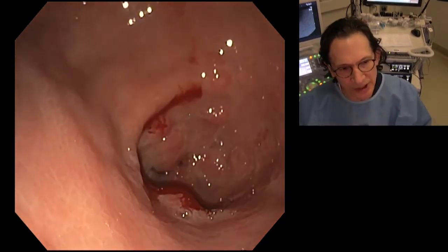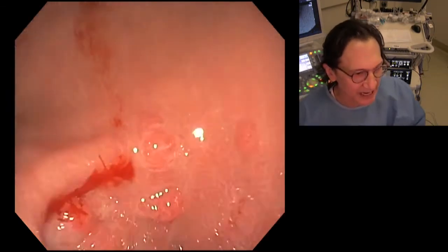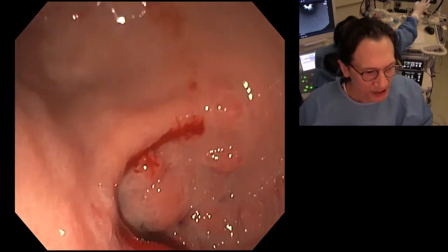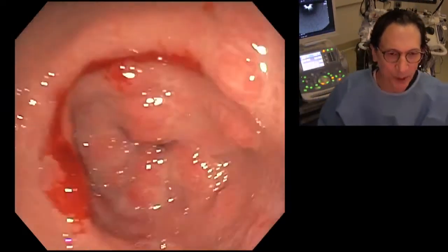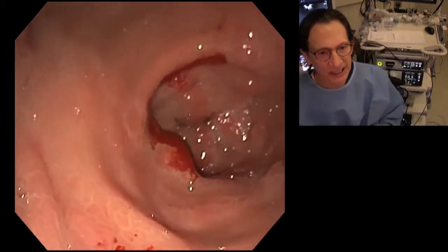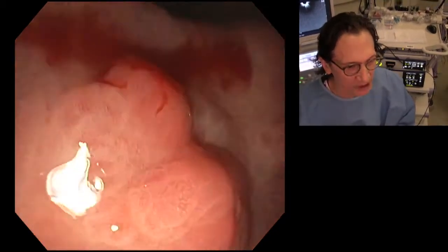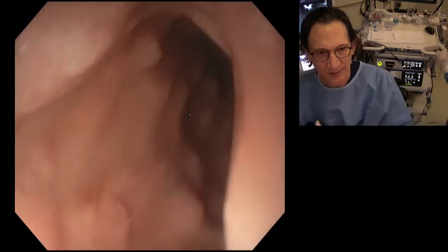You can see that there's a little bit of bleeding, spontaneous bleeding that we see in the antrum. So this is probably some hemorrhagic gastritis. I don't see an ulcer or anything like that. But this is an endoscopic ultrasound, so it's also an endoscopic procedure. And with the oblique optics, we can see endoscopically the antrum, the pylorus, and we're just going to pop into the bulb here, make sure that the anatomy here looks normal.